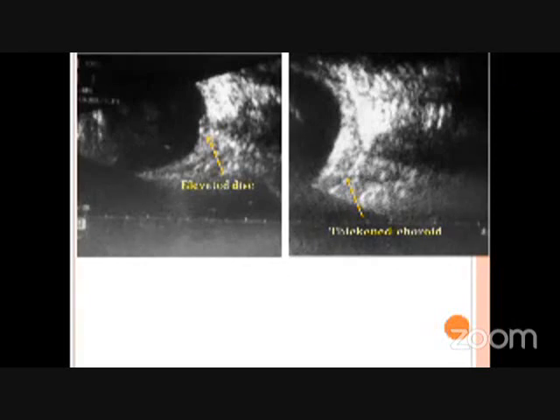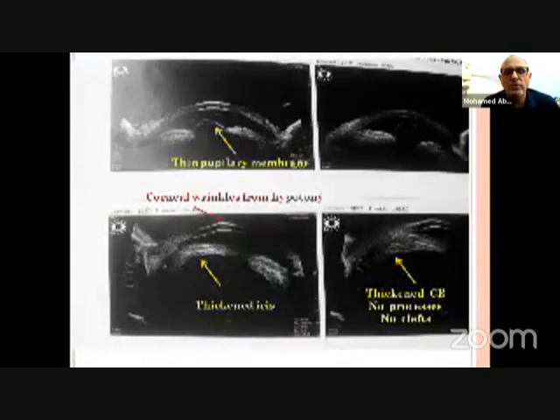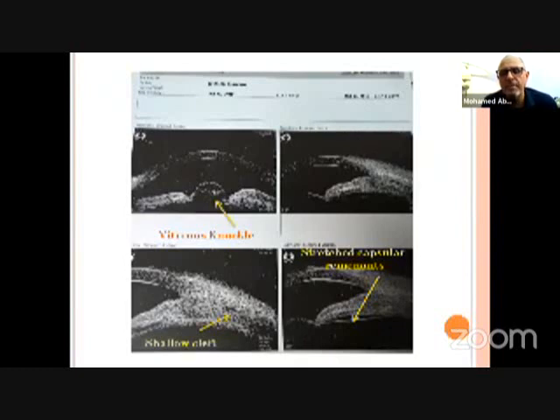So this is an elevated disc, as you can see, with markedly thickened choroid. I did a UBM, which showed just a thickened ciliary body with no processes on it. Vitreous prolapsed. When I did a better resolution UBM, it revealed remnants of the capsular bag stretching over and pulling over the ciliary body with a very shallow cleft. That can explain her hypotony.